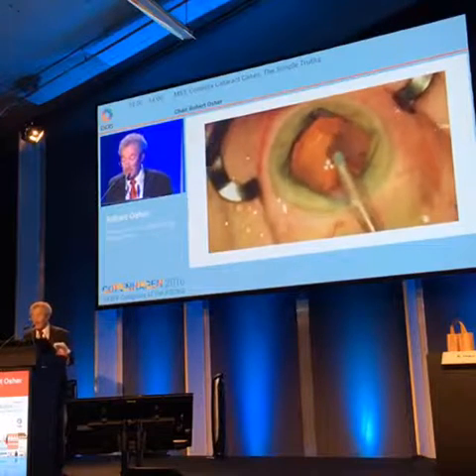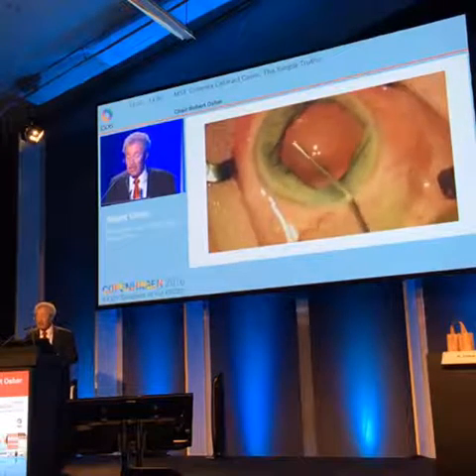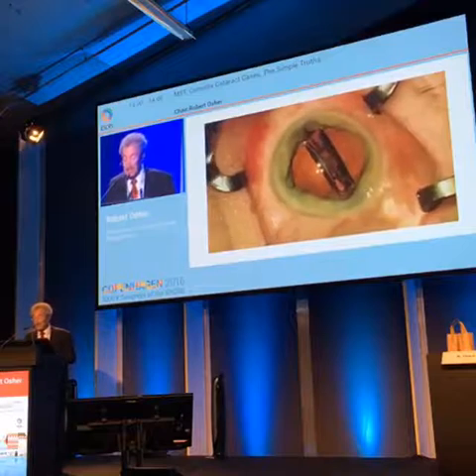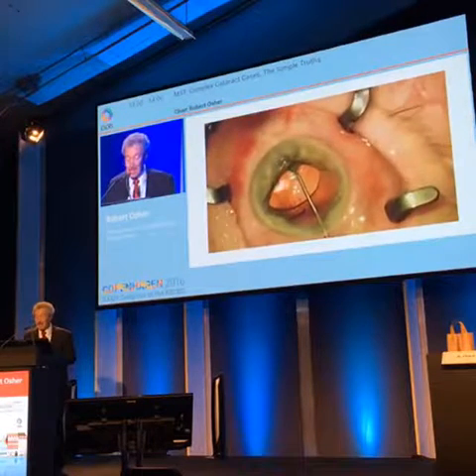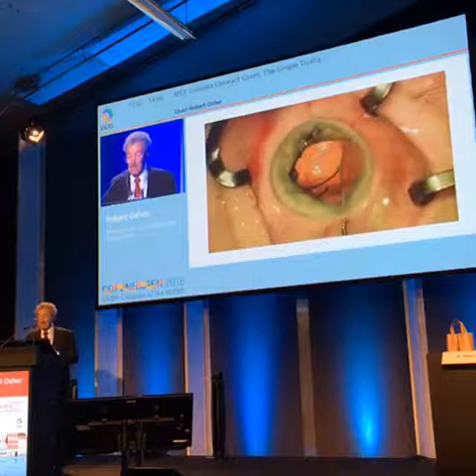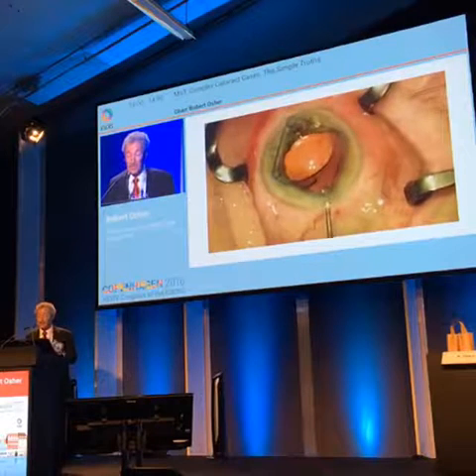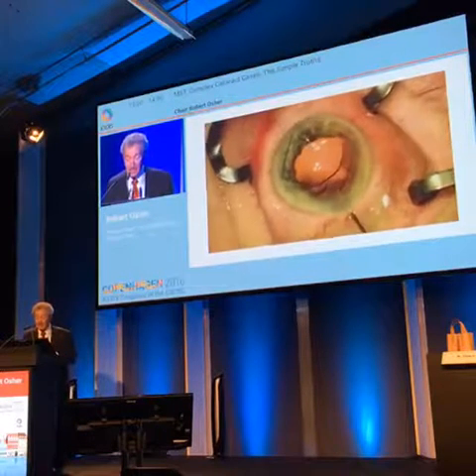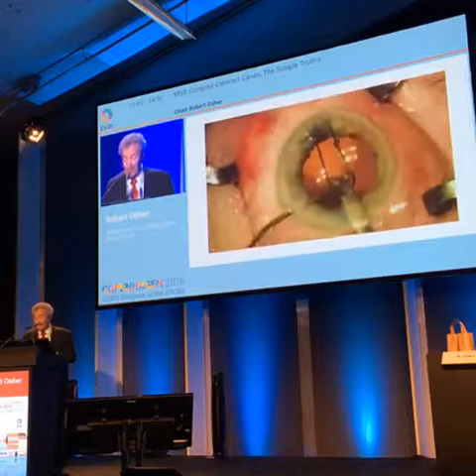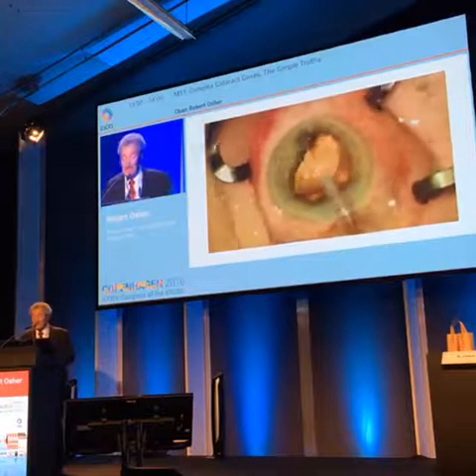I'm working a little bit more tremulously than I usually do because this, as you can imagine, was an adrenaline-provoking experience. I quickly inject her lens and place it into the capsular bag, and then I'll remove the Malyugin ring. Boris, I don't know what I would have done if I had iris hooks or something else in this case. The ring really made it easy and very fast. I'm not a fast surgeon by any means, but in this case, I went as quick as I can. You can see that I did.